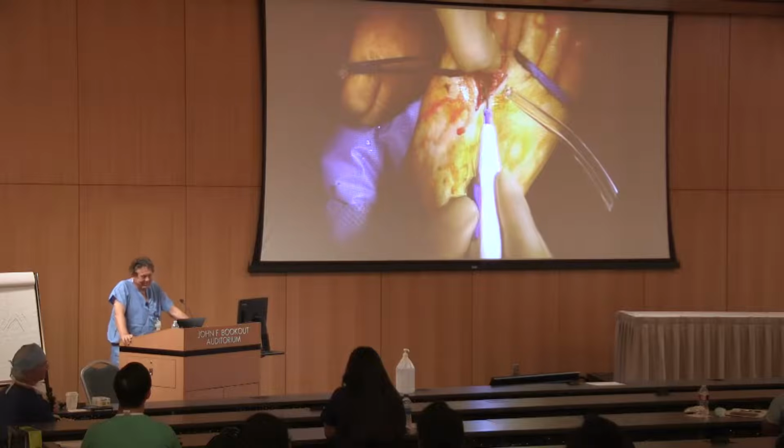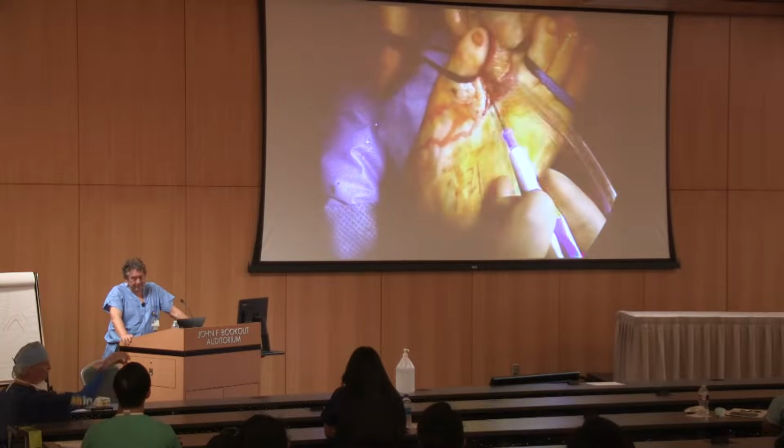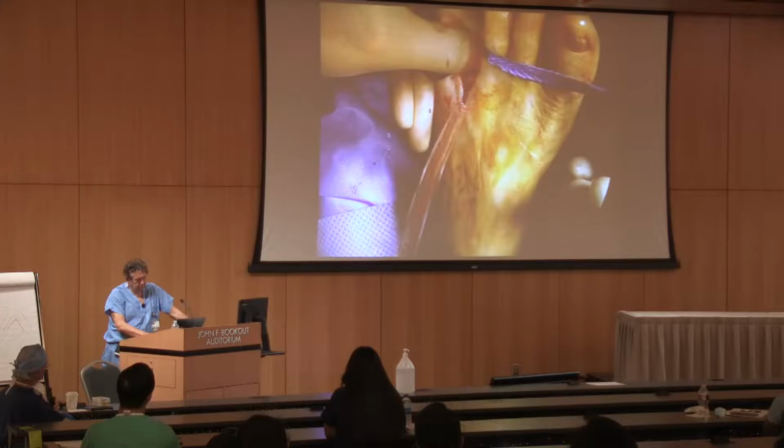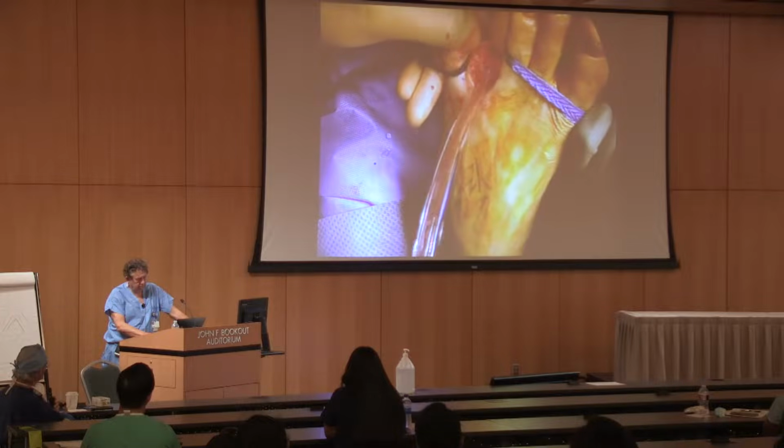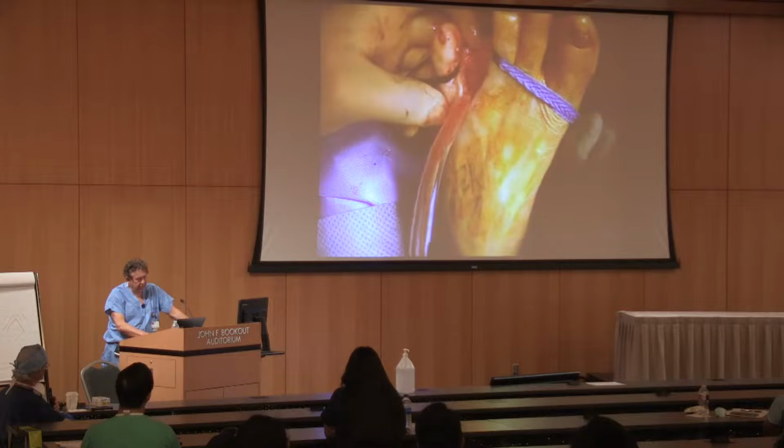Yeah, I mean, some people like to do that. It is true that moving the toe back and forth helps, because actually the metatarsophalangeal joint is a lot more proximal on the foot than it appears topographically. And so moving the joint helps you to identify where that junction is. So that's probably the metatarsal head right there that we're going to debride out.